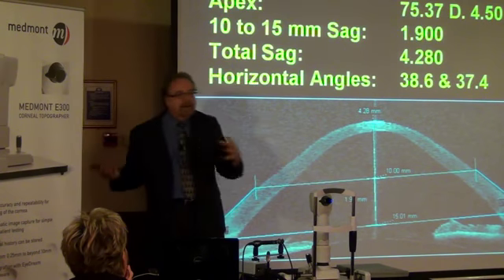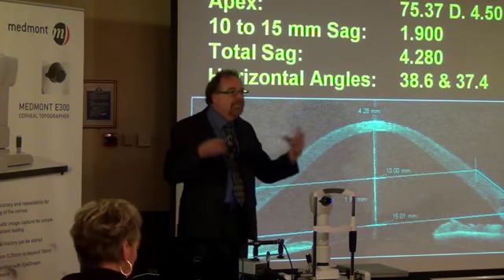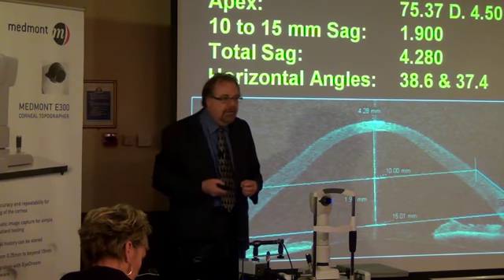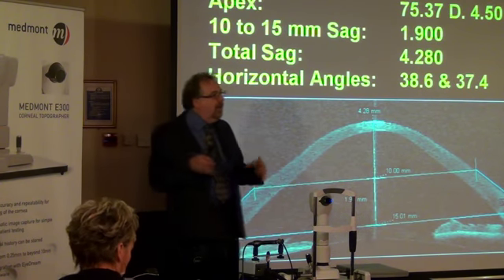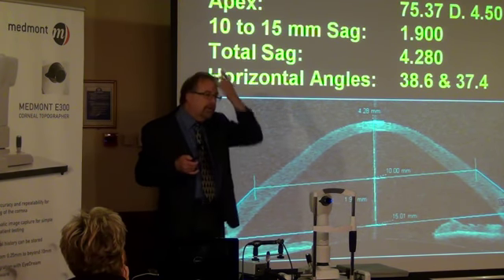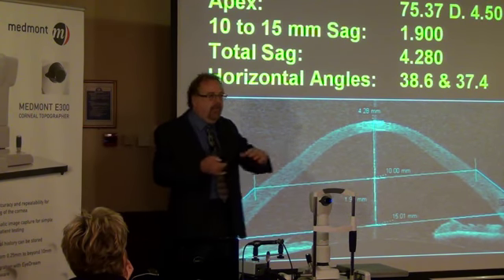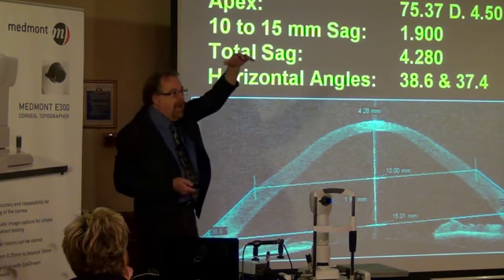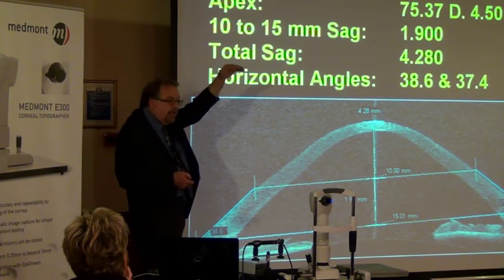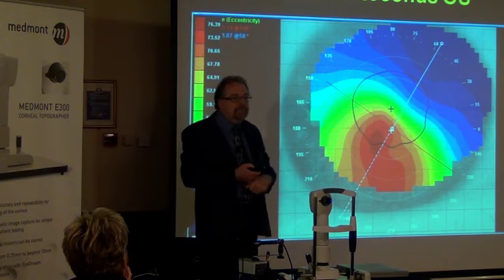So what started out as a very kind of bizarre condition, keratoconus, you can see that all of that action, or the majority of that action, is really taking place in the center 10 millimeters. So it's imperative that we have lenses with enough sagittal height to be able to incorporate that area.